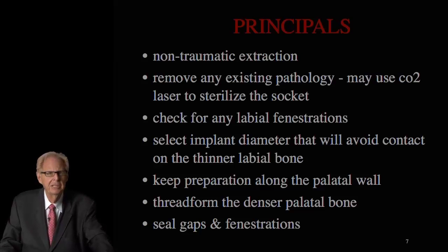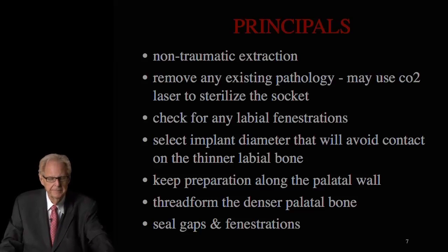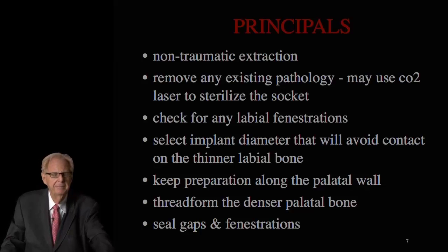Now, the implant achieves its stability from the mesial, distal, and palatal wall, or lingual wall. And we want to keep the preparation along the palatal wall. We want to keep the implant more against the palatal wall in sort of a vertical position, so that you also have the opportunity to use a screw-retained abutment.